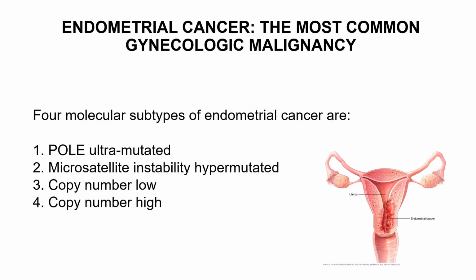This allows us to classify endometrial cancers based on their distinct molecular profiles, providing valuable insights into prognosis and guiding personalized treatment strategies.